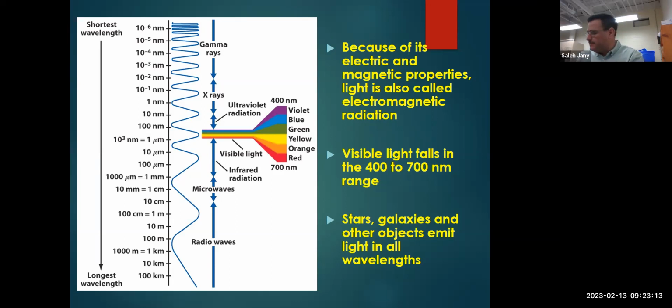And they discovered that light is not only visible light. The visible light is a very narrow part of the whole light. The light includes microwave, infrared, ultraviolet, X-ray, gamma ray, and radio wave. All these are light, but they differ in their wavelength. The radio wave's wavelength can be kilometers. The microwave is in centimeters. Infrared will be microns. The visible light could be in microns too.